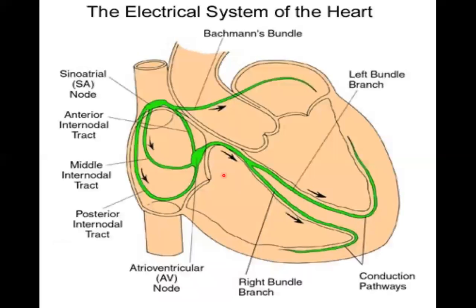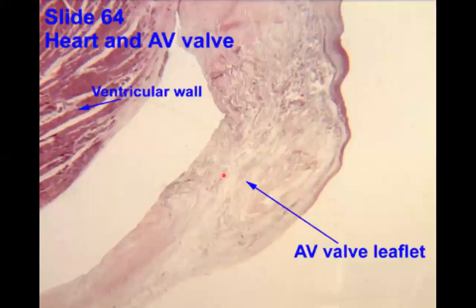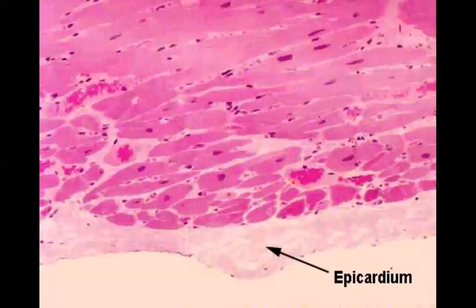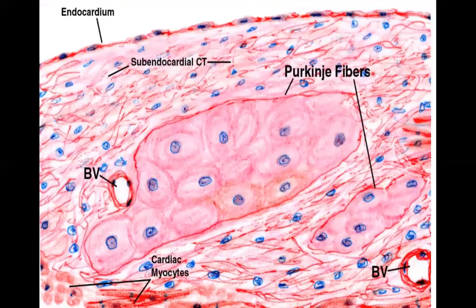When we see it under the microscope, I see it in this shape. We will find it is a cardiac muscle but larger, and its cells, look here, I have a view of it. This is a diagram, just a diagram to clarify it. See the difference between the myocardial cells, the cardiac muscle, and the Purkinje fibers. They are collected together and enlarged, as if hypertrophied, and centrally located nuclei appear in this shape. Purkinje fibers are collected together and hypertrophied.